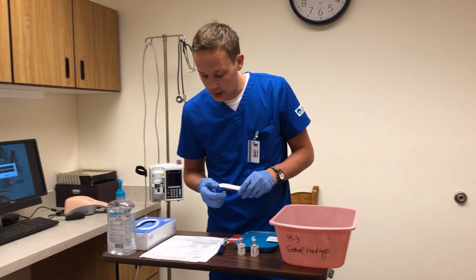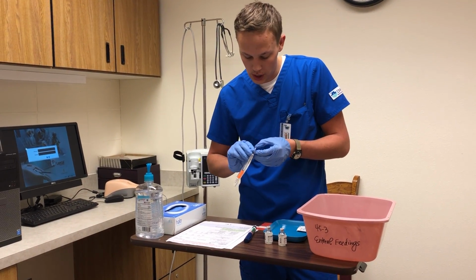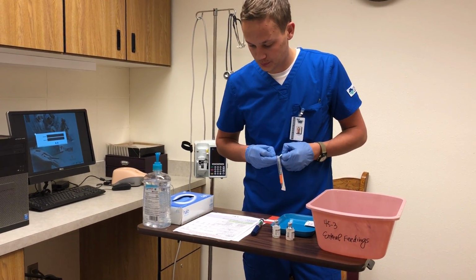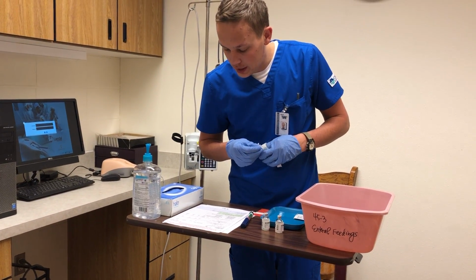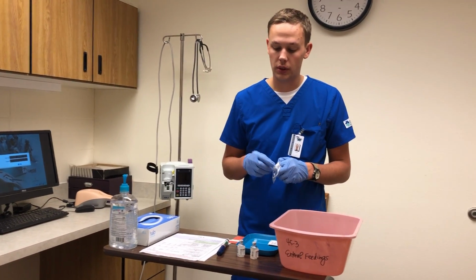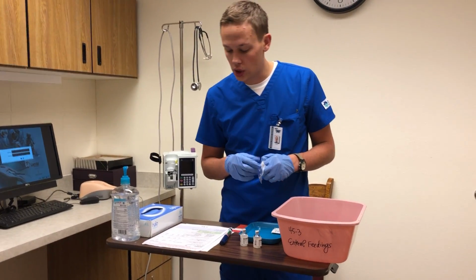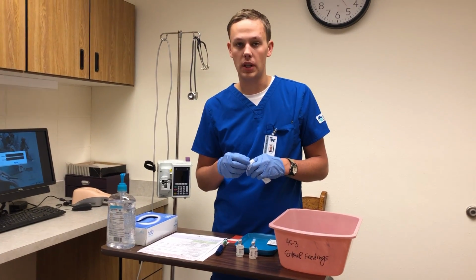And so next I can start by getting my needle, if I can find which end. And so the NPH insulin is asking for 15 units, and so I'm going to pressurize that one first with the 15 units, but then I'm going to draw up the regular insulin first and then go in and get the NPH insulin.